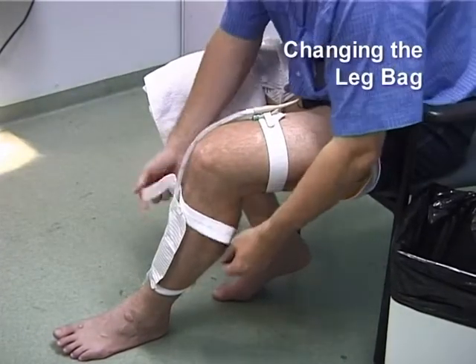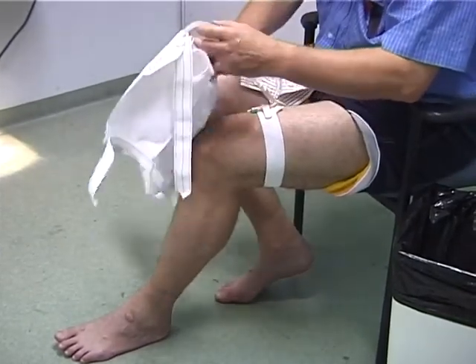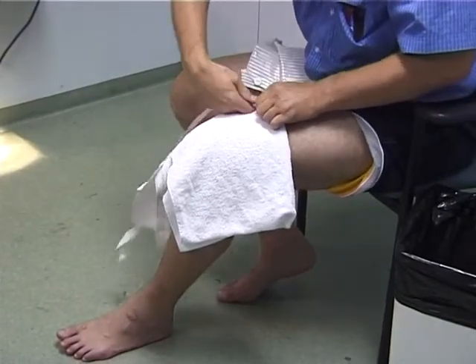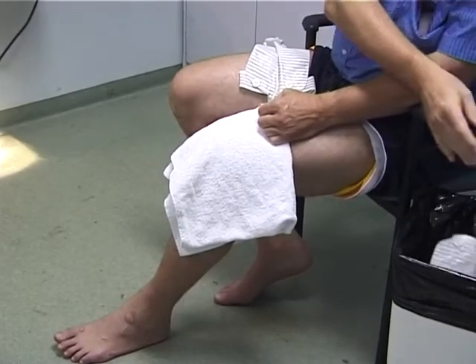Firstly, disconnect the leg bag straps and have a towel handy to catch any leakage of urine whilst disconnected. Grip the catheter firmly and disconnect the tubing using a twist-like action and discard this used bag.